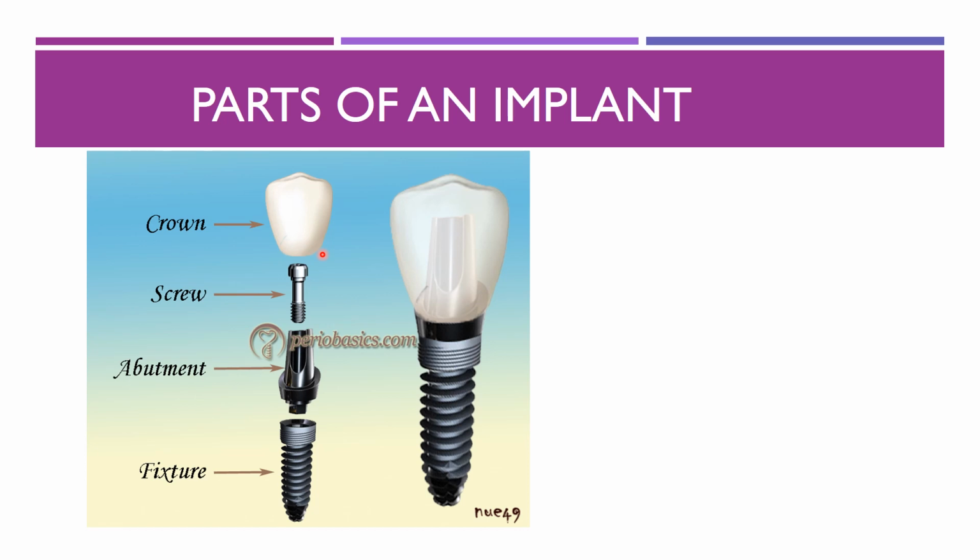So this cover screw can be called either a cover screw or implant obturator. Okay. So in this two-stage implant, this will be placed to prevent soft tissue and bone from invading the abutment connection area during healing. Whereas we have a healing abutment also over this. So if it is a non-submerged type, we use the healing abutment. So it will come over it. Okay. So that is to heal or shape the gingival tissues after the uncovering procedure for the future implant placement.